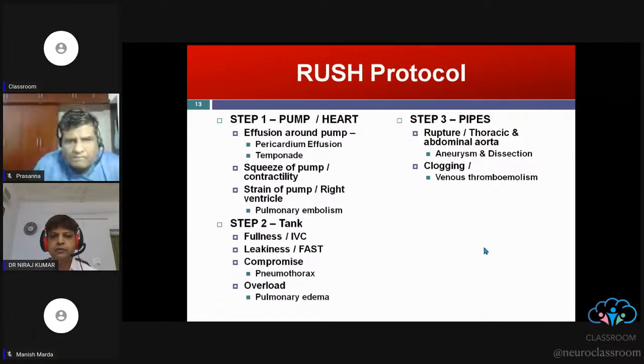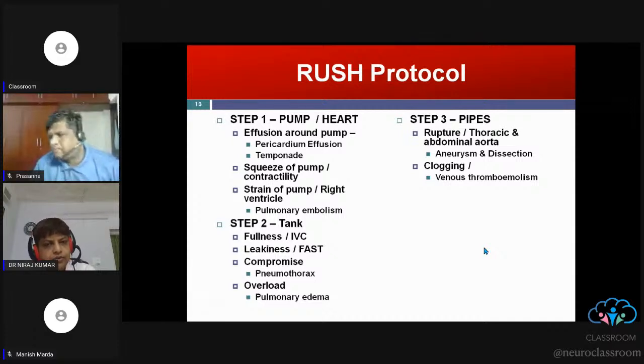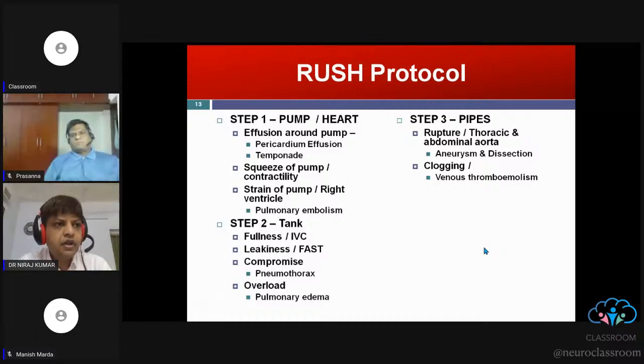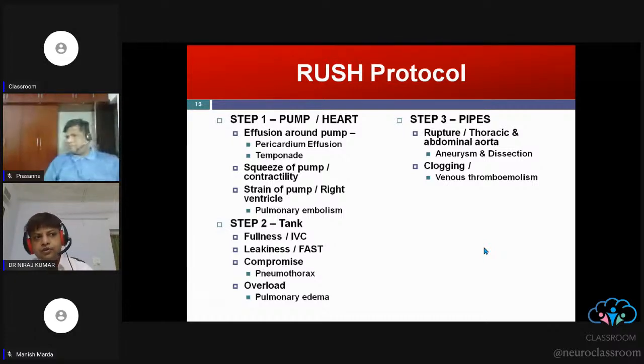So we have completed the 4 views of basic echocardiography: parasternal long axis, short axis, apical 4-chamber, and subdiaphragmatic. This basic understanding of all the 4 views is very useful. And always remember that it is sometimes not possible to acquire all the 4 views in every patient. So sometimes one view may be missing, or in some patients one view is not appropriate.